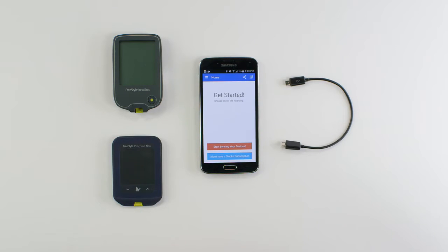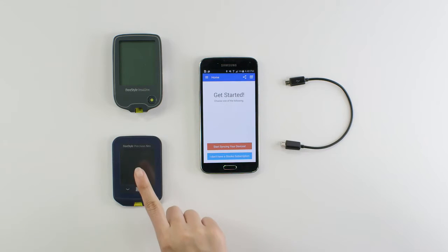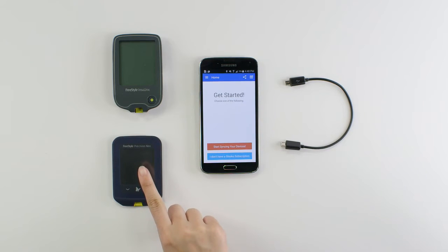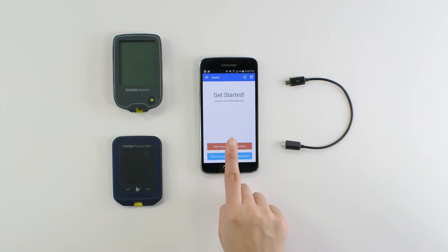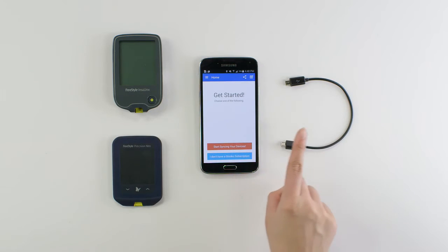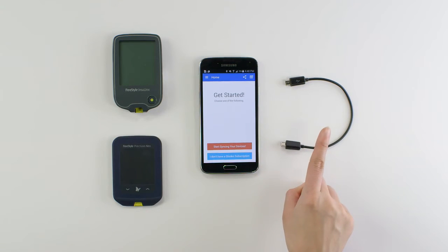In order to do this you'll need a freestyle USB device, an Android device with the Gluco app installed, and a micro to micro USB on-the-go cable.